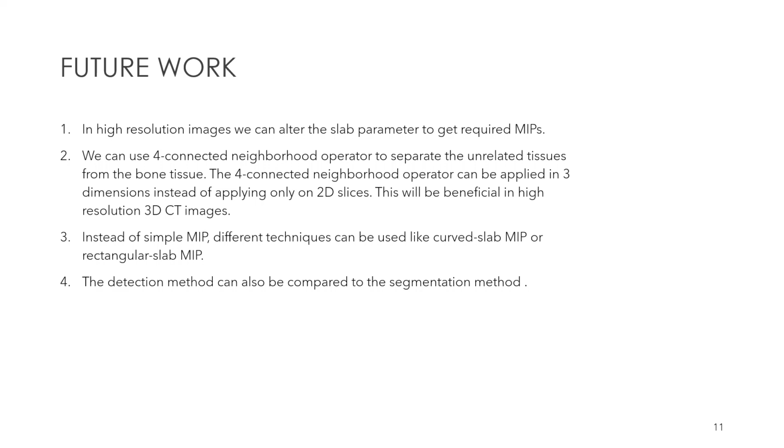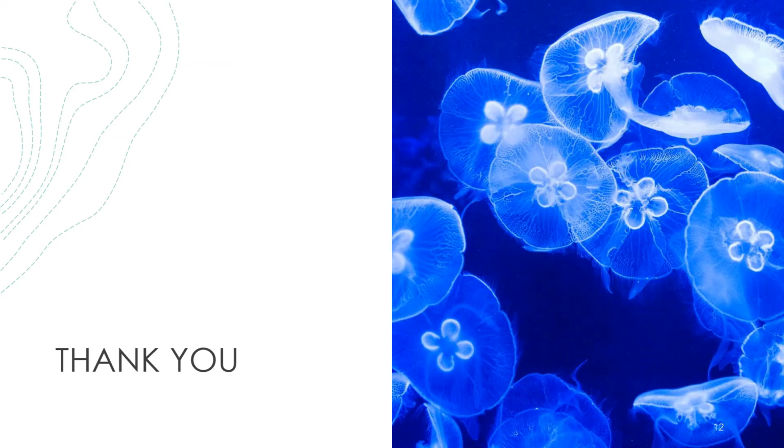And also instead of simple MIP, different techniques can be used like curved slab MIP, rectangular MIP or weighted MIPs. The detection method can also be compared to the segmentation method. That's all for the presentation.